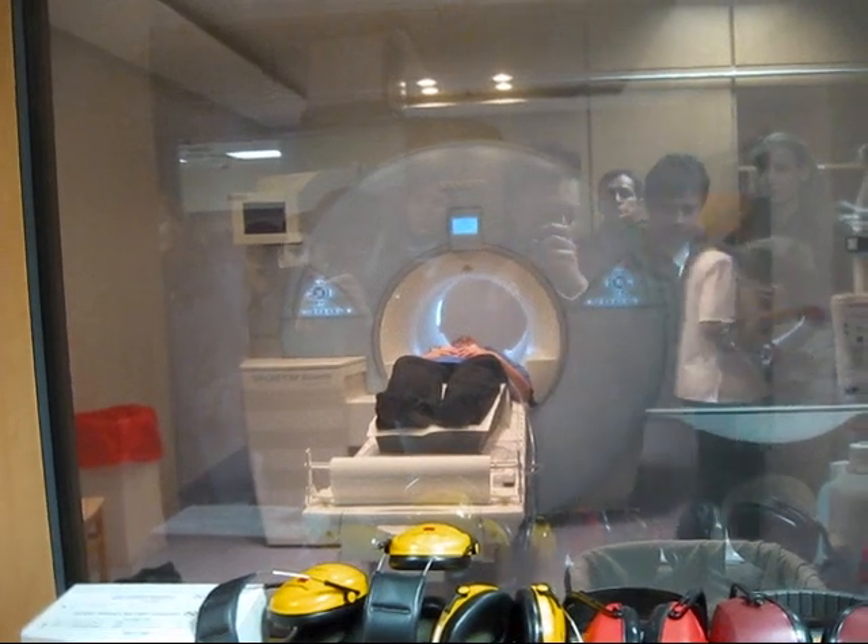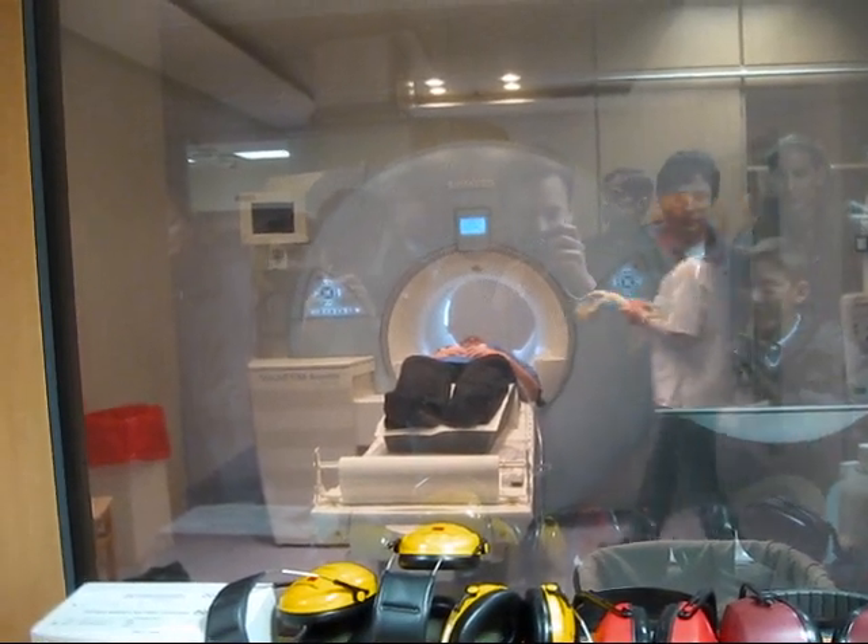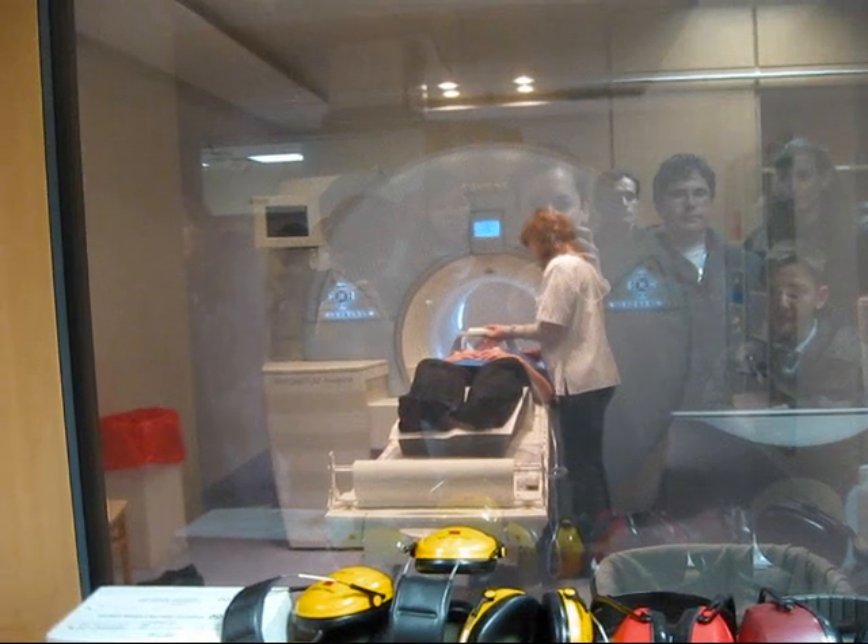You can probably hear a noise that sounds almost like a singing bird. This is actually the helium cooling for the MRI device.